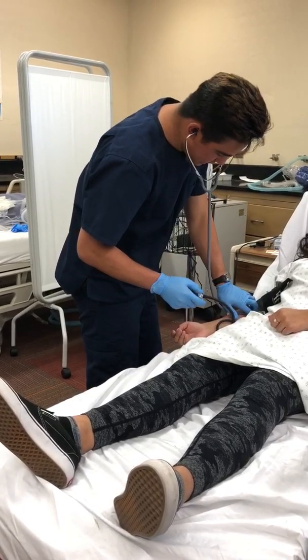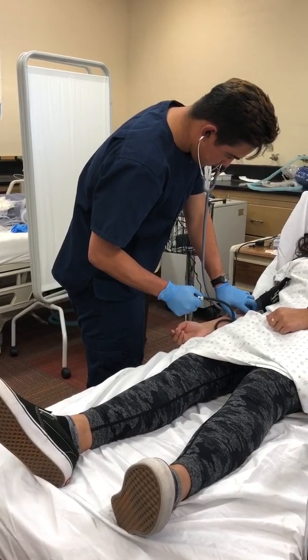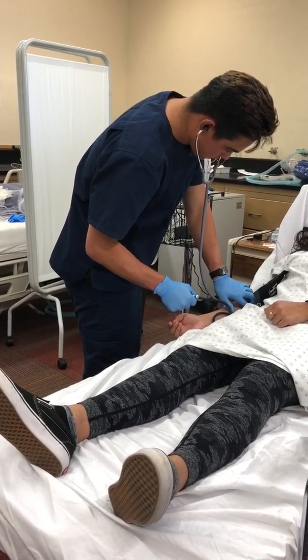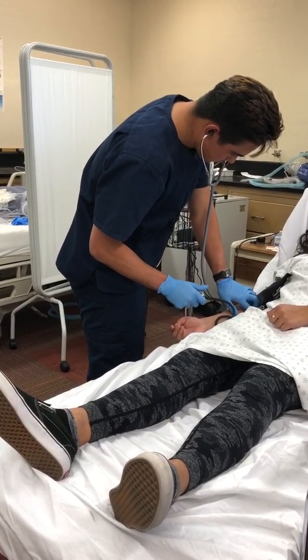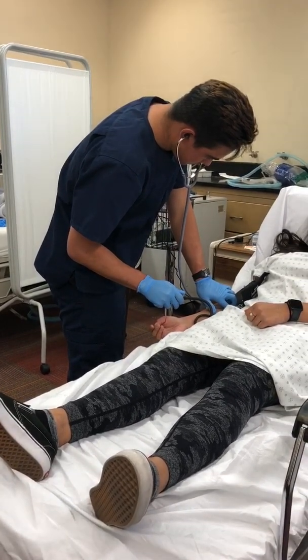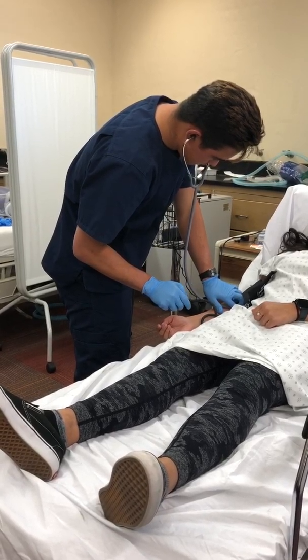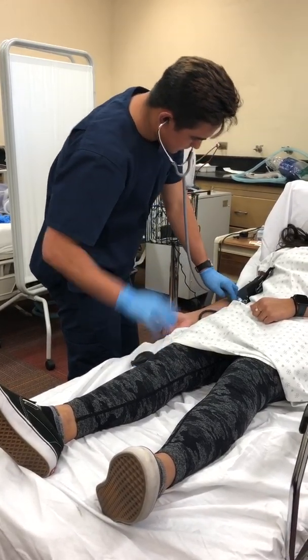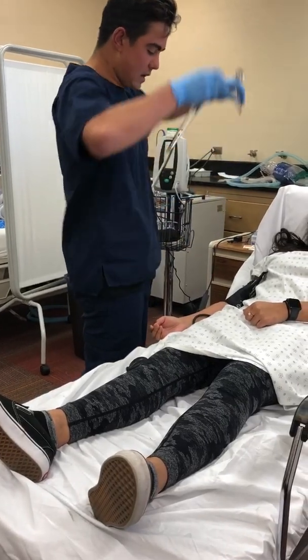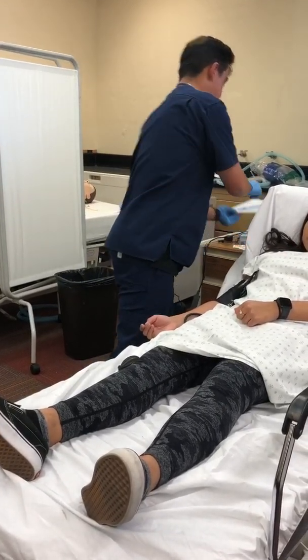It's going to get a little bit tight. We're going to bring it back down as quickly as possible, okay? Blood pressure is 128/86. I'm going to go ahead and make note of that.